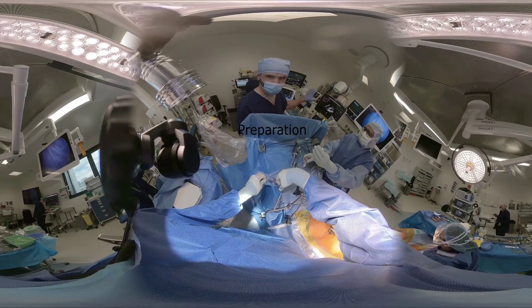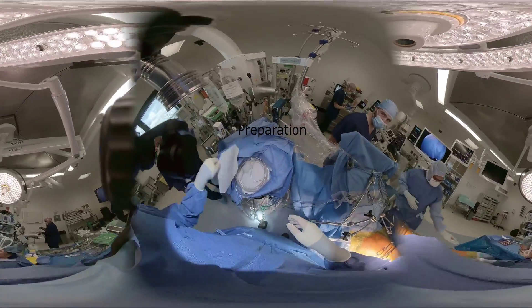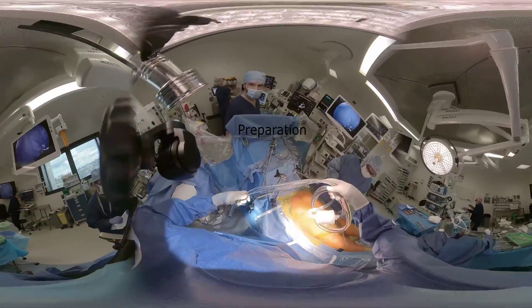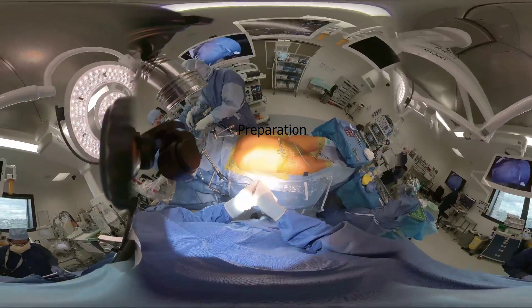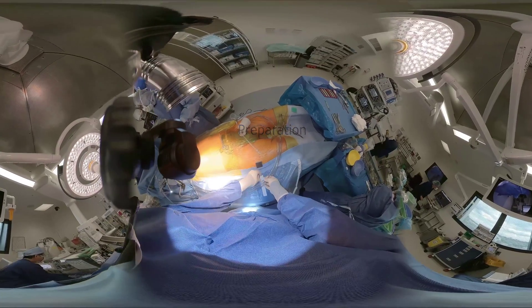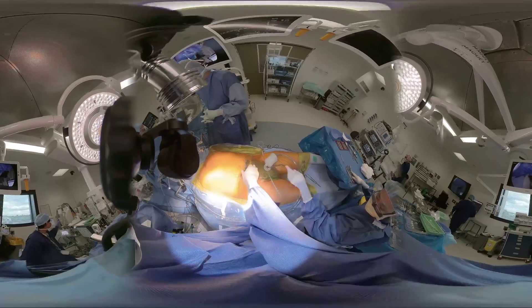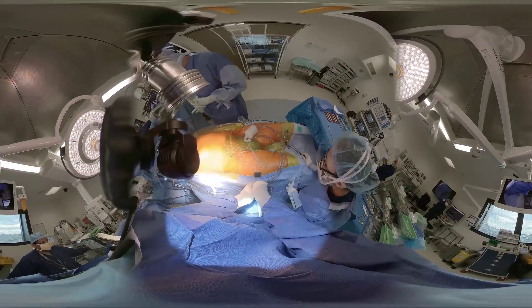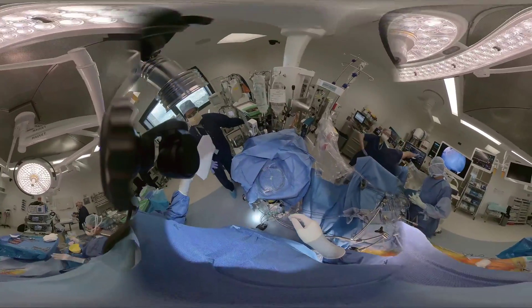Anesthesia is provided as per the institution's standard protocols. Single-lumen intubation is routinely used, although double-lumen intubation can be used for single-lung ventilation in complex cases requiring difficult dissections. Transesophageal echocardiography is routinely used, with particular focus to aid correct cannula placement and provide both anatomical and functional views of the mitral valve.